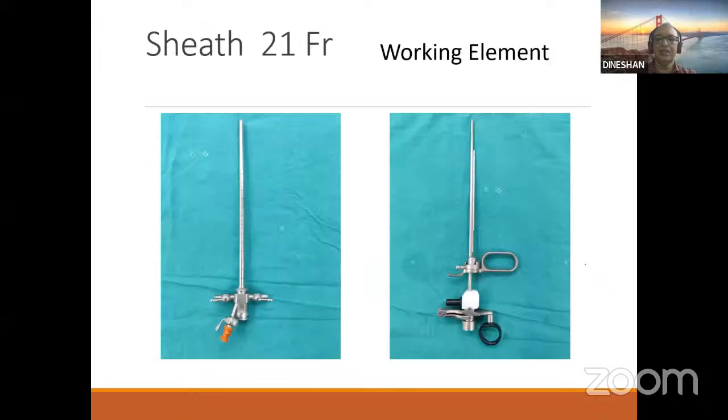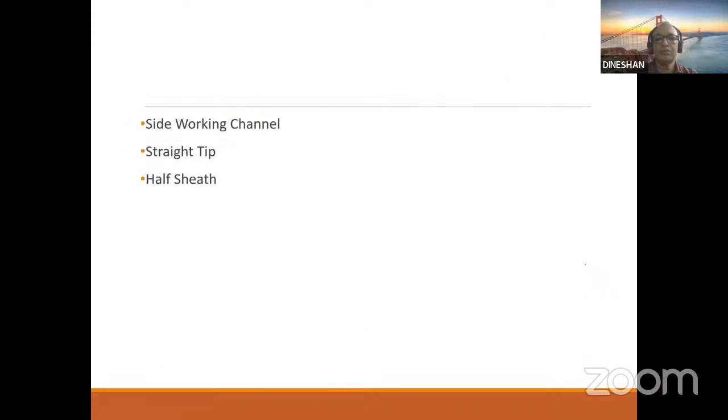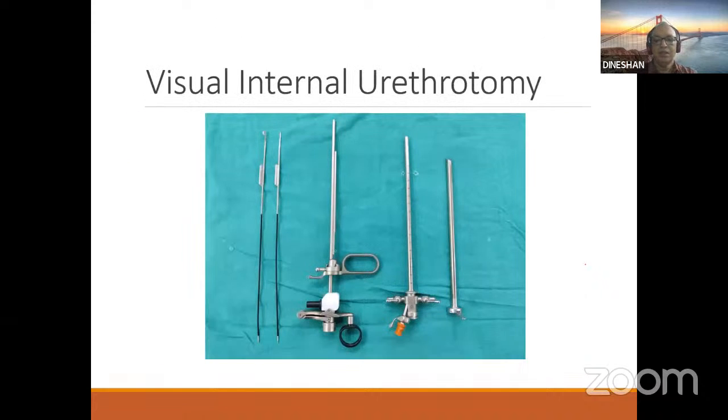And there is another thing, you have a half sheath. This is the half sheath, which can be connected to the main sheath.